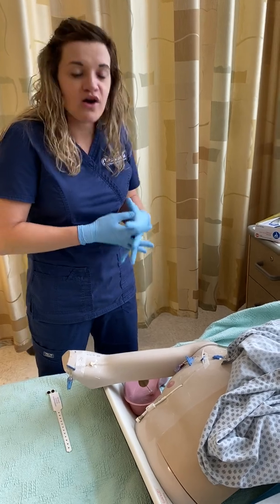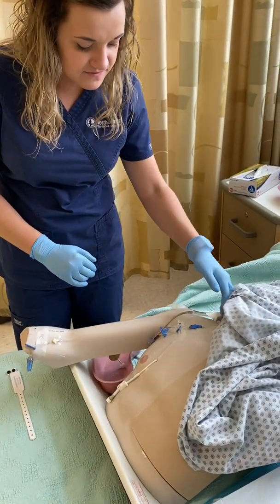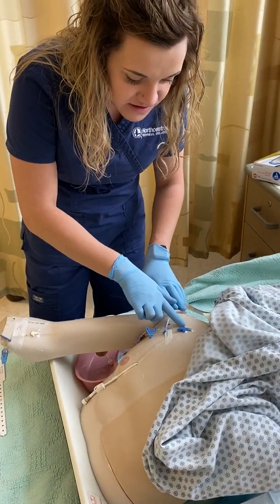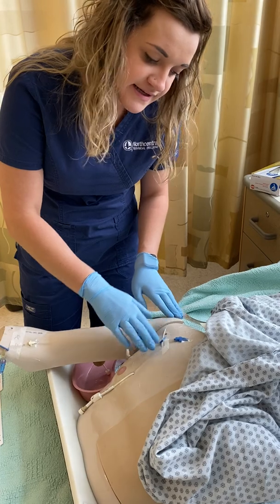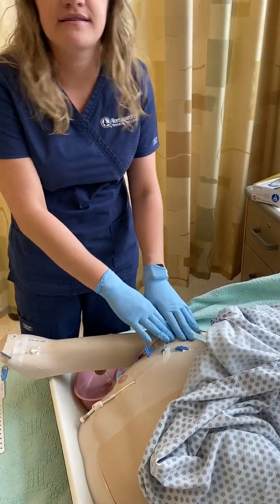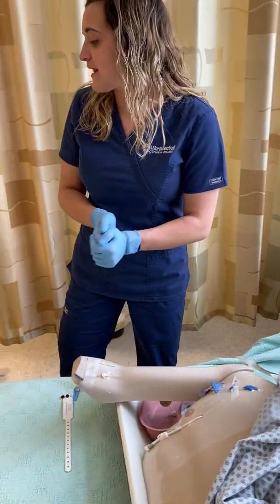So now I'm just going to go ahead and assess the access device. I'm looking for redness, no edema, ecchymosis, drainage, and it is very well approximated and the dressing is intact. So we can go ahead and give that medication.